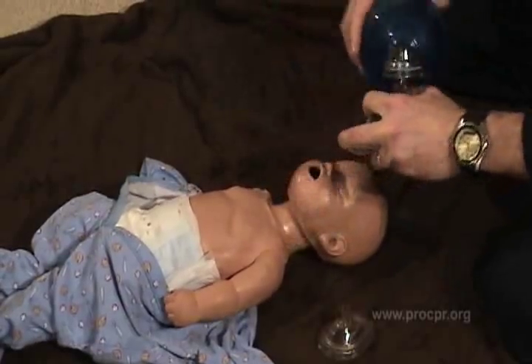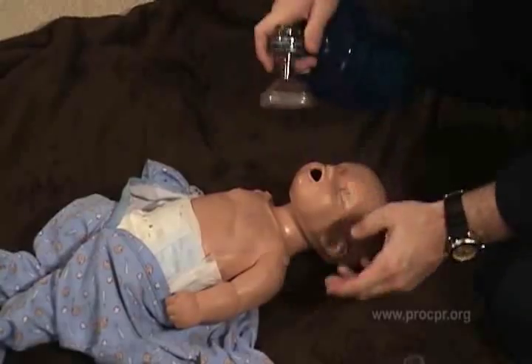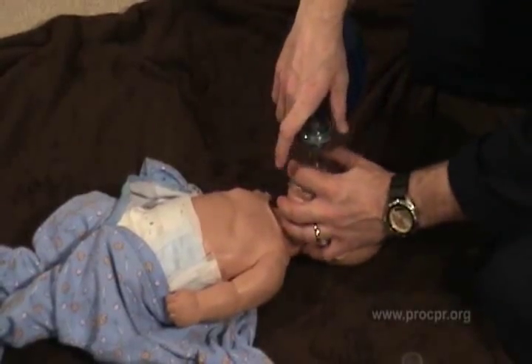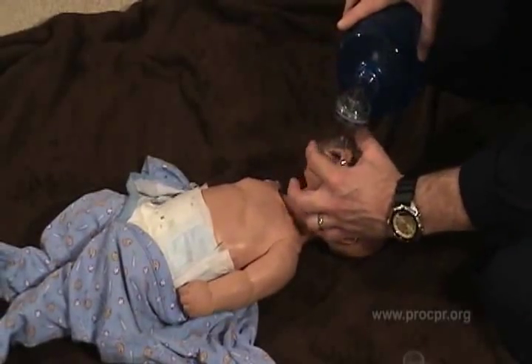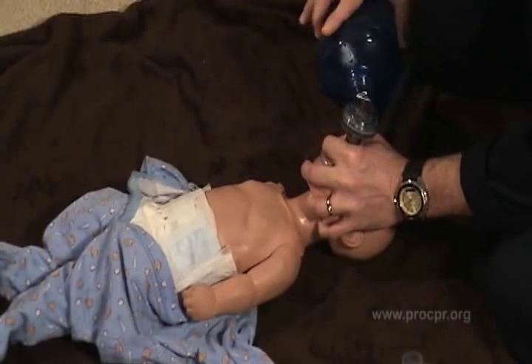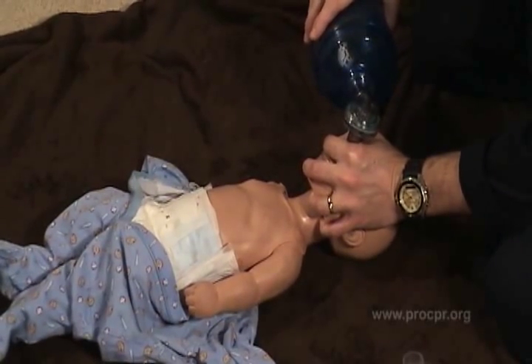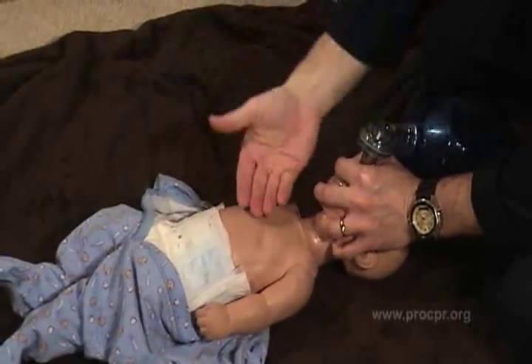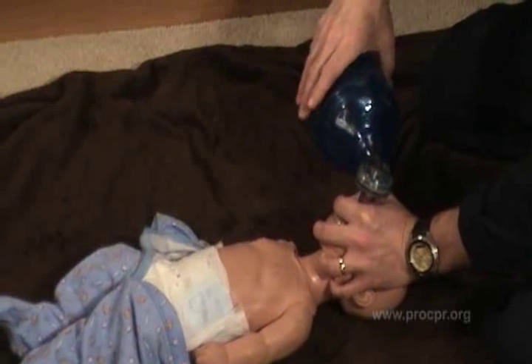So if we do have an infant size mask, that's the best thing to use. It's made for the baby. It fits perfectly over the nose and around the mouth and above the chin area. Again, we're going to use virtually the same technique. And then baby size ventilations, one breath every 3 seconds, looking for good chest rise and fall to make sure that we're ventilating this patient adequately.